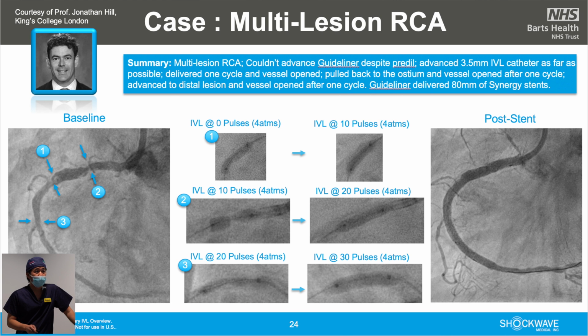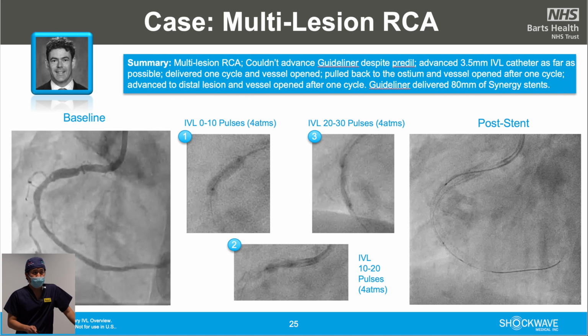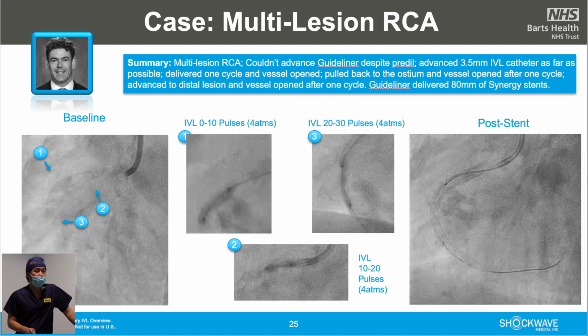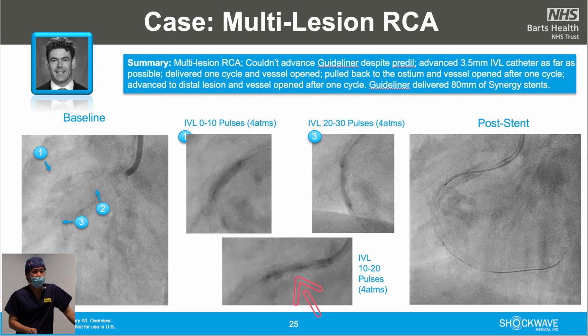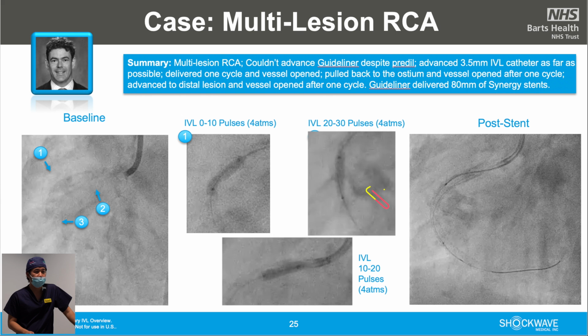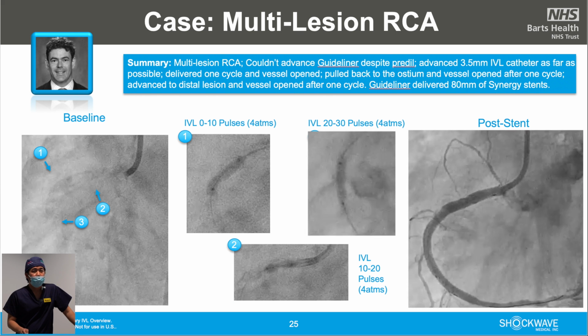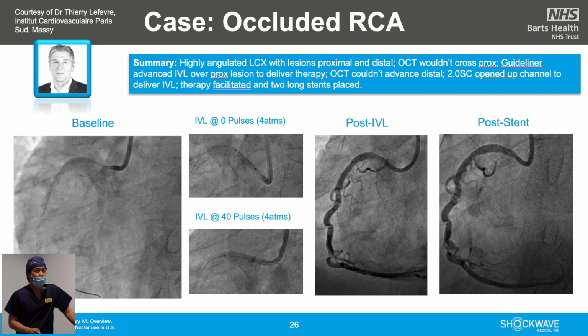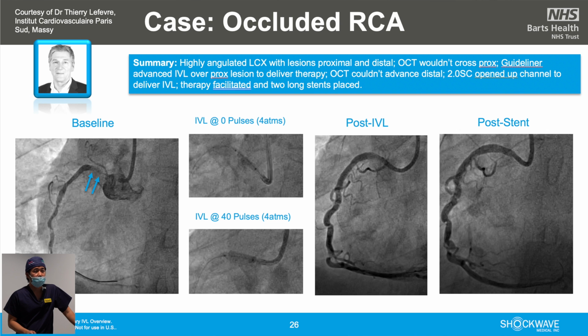And as you can see here in one of the balloons, there's a dent there. That's so heavily calcified. So this is without yet a therapy. So after 10 pulses, you can see the balloon expanded in there. And the same with proximal area. This is so very calcified there, around 90% stenosed. And after 20 pulses, it cracks the calcium, same as here. And this is the post-stenting image. So in here, it's around proximal area. It's really calcified. And then after 40 pulses, it expanded beautifully.